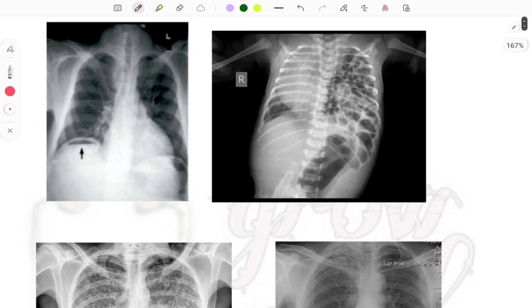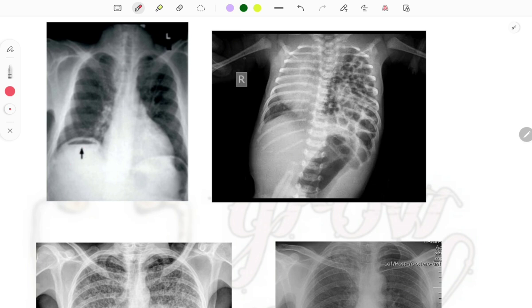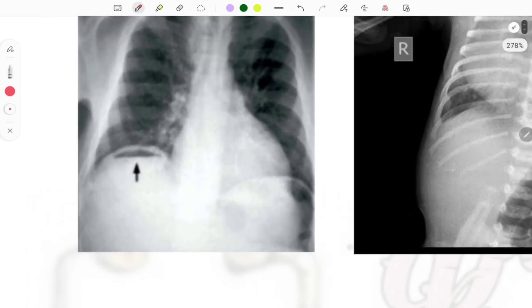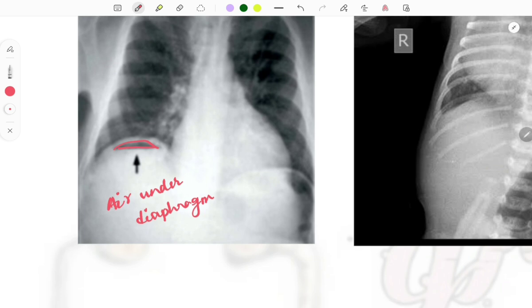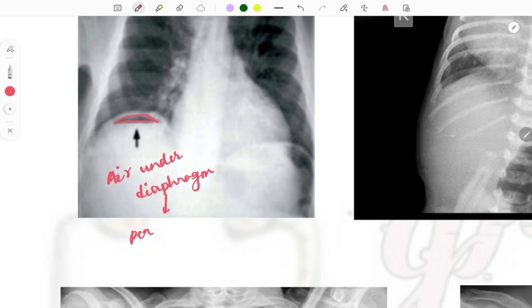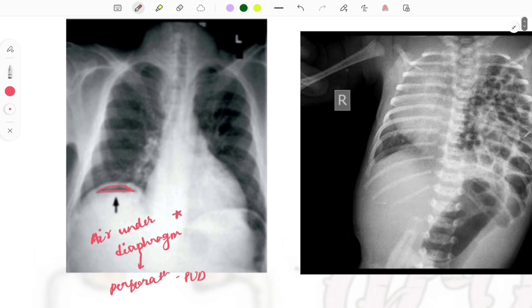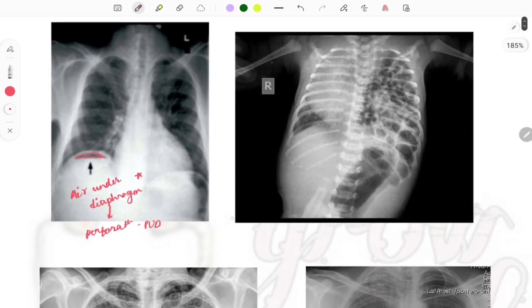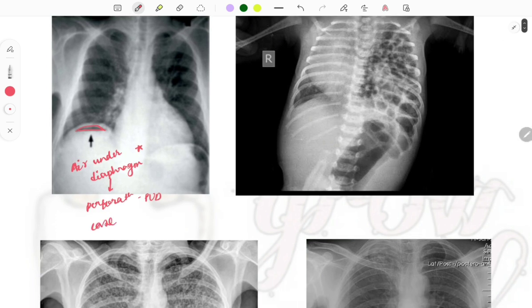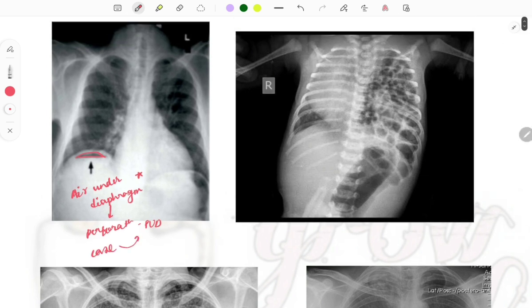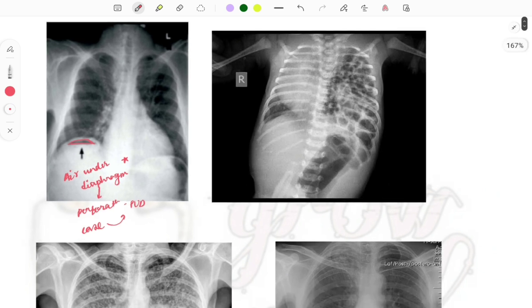The first image shows an arrow mark pointing towards the diaphragm. You can see air under the diaphragm. The cause of this air under the diaphragm is perforation of the bowel, and the most common cause is peptic ulcer disease. Remember three things: air under diaphragm, perforation, and peptic ulcer disease. If a case involves peptic ulcer disease with abdominal pain, this X-ray finding applies.